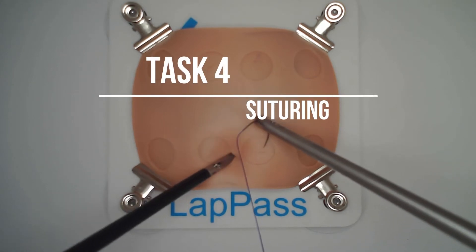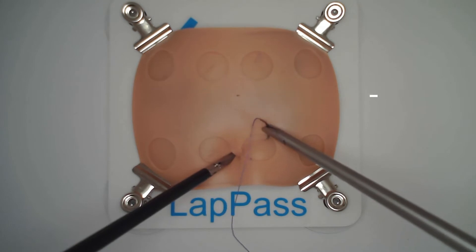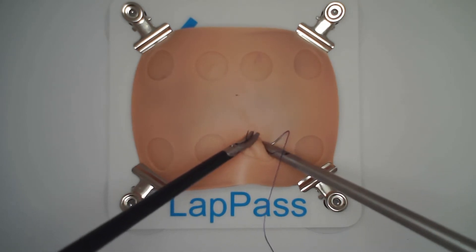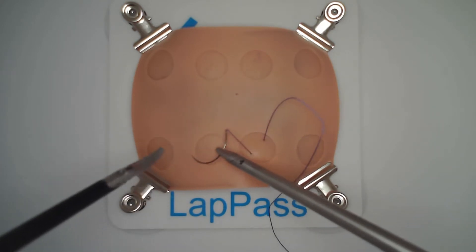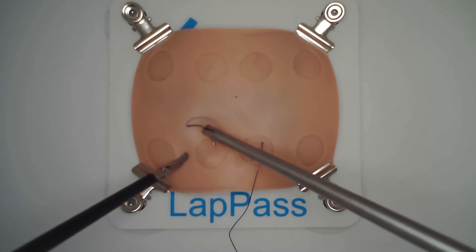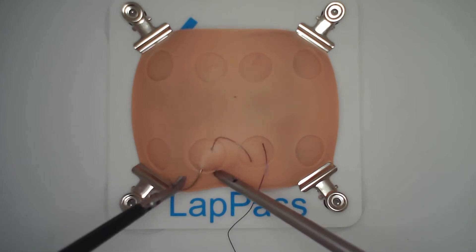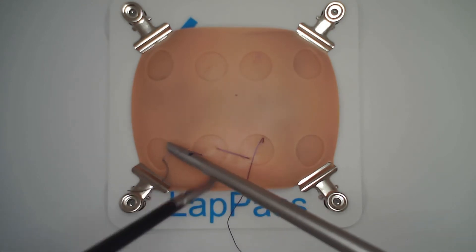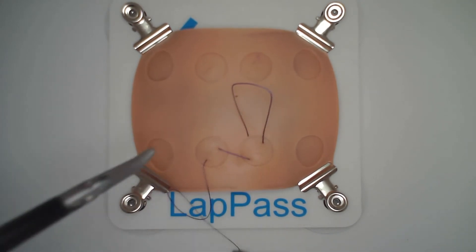Welcome to task four of the lap pass. This is the suturing skill that most people find difficult. It involves placing two separate sutures within the circled areas and drawing these together with an acceptable surgeon's knot under a degree of tension so the knots are secure. You have six minutes to complete this task.